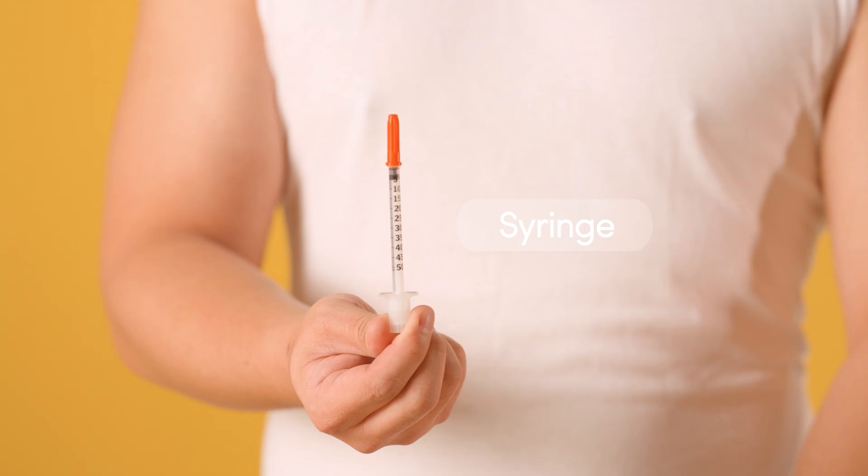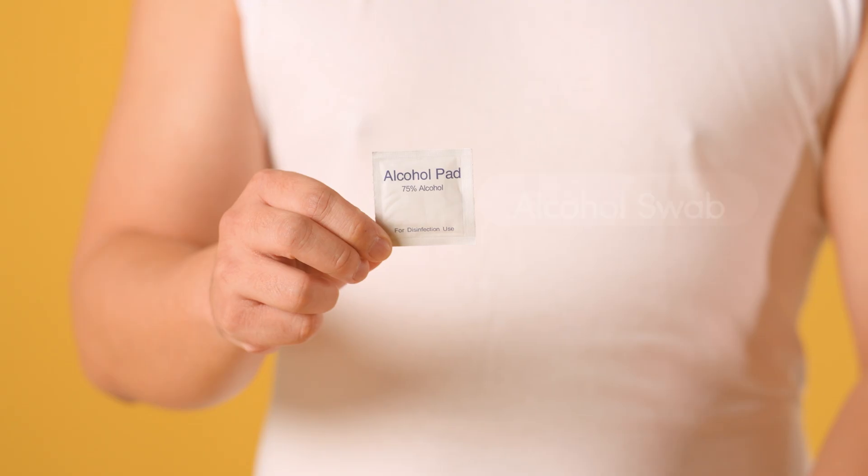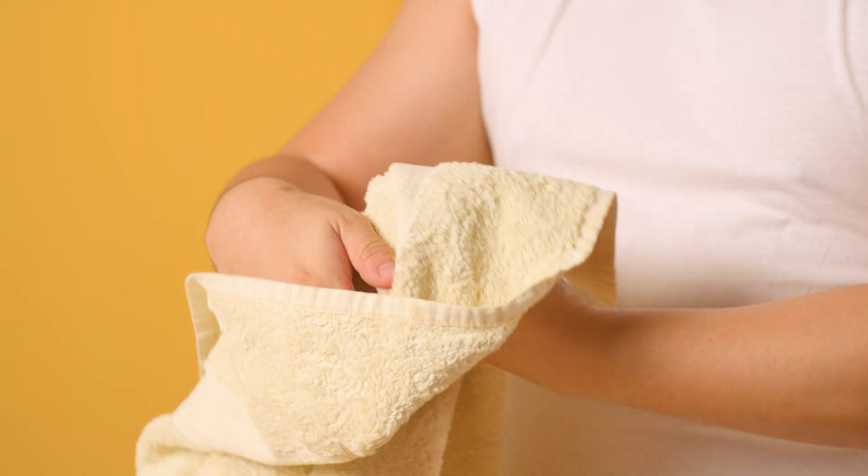To begin, gather your supplies: sterile syringes, your prescribed medication, sterile water, and an alcohol swab. Always wash your hands thoroughly with soap and water before you start.